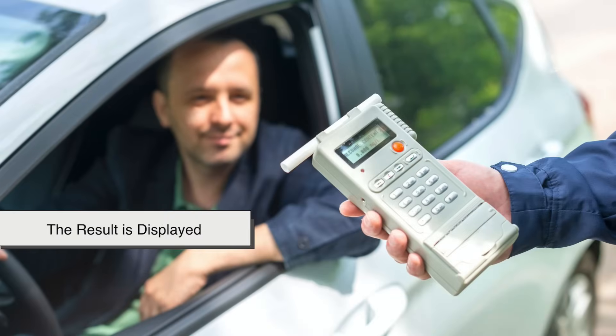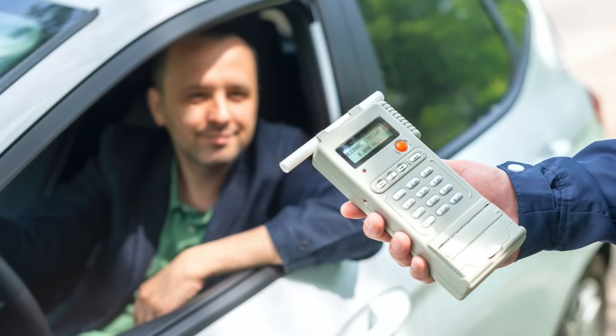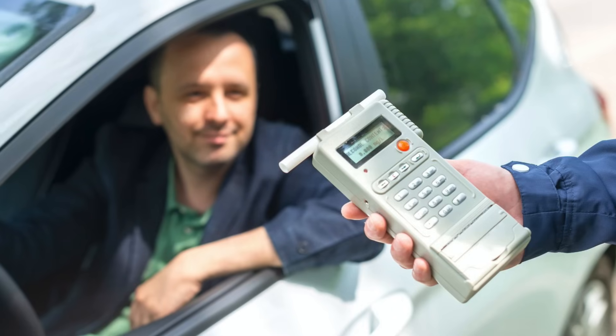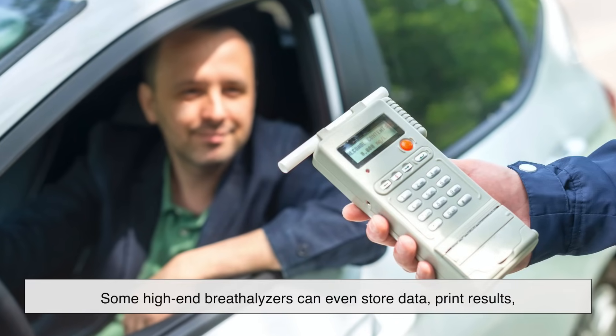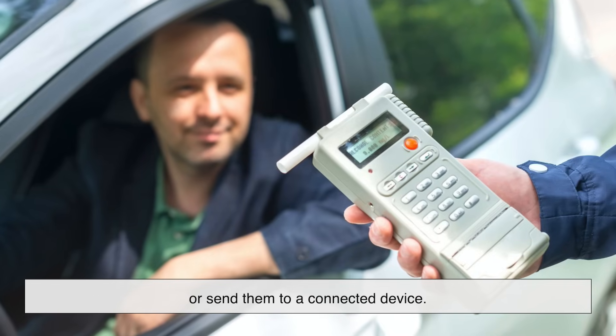Within seconds, the breathalyzer displays a numerical value indicating the estimated BAC. Some high-end breathalyzers can even store data, print results, or send them to a connected device.